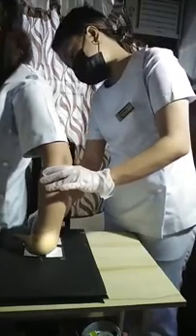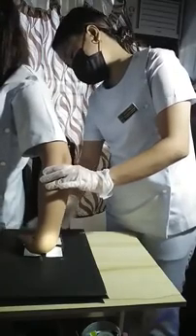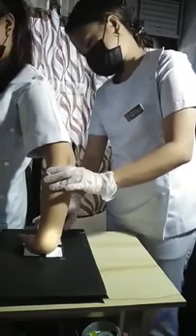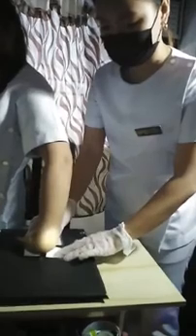Part position, so it should be centered dorsal aspect of carpals to IR. The back of the hand should be in contact with the image receptor and at a perpendicular angle with the forearm. Central ray, 45-degree caudal angle, 1.5 inches cephalic of bend at wrist.